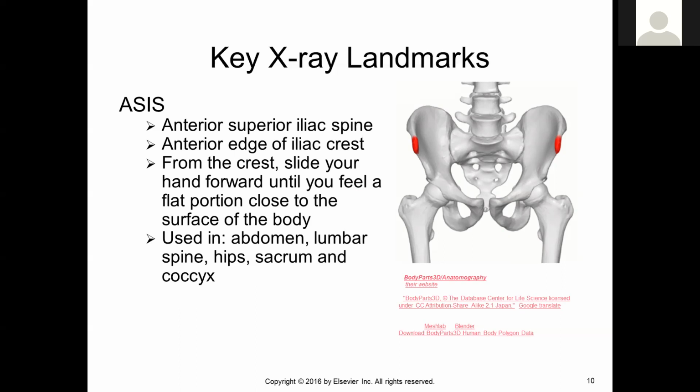That block of bone where muscles attach lines up with the superior portion of the pubic symphysis. And you can see that here on this illustration. The greater trochanter is in line with the pubic symphysis. So when you are positioning for this projection, rather than poke around below your patient's bladder, you can feel for the greater trochanters and not have an embarrassing palpation for you or your patient.